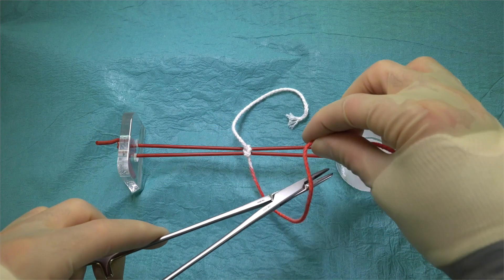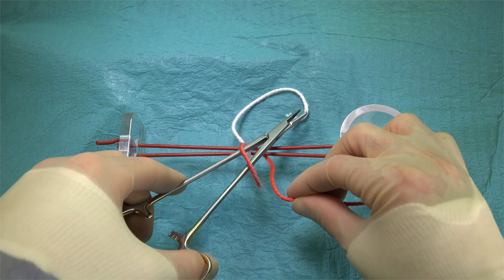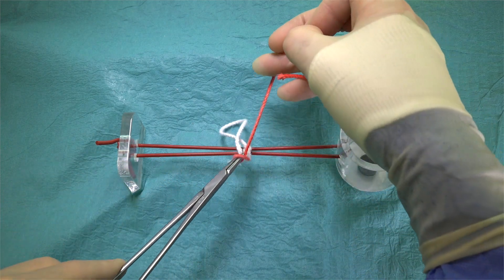Lastly, we perform an additional single throw, to help secure our surgeon's knot and prevent it slipping and coming undone.